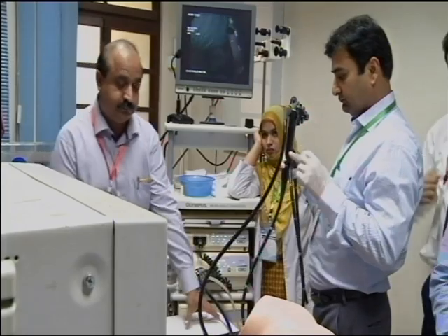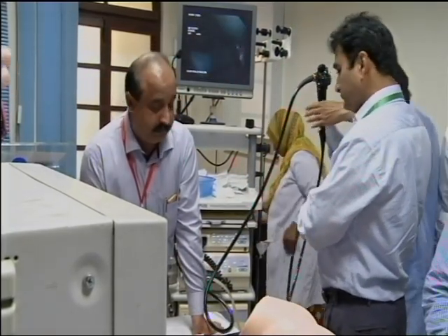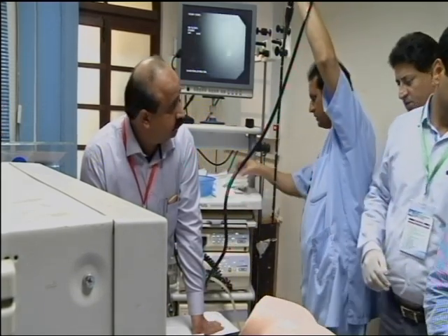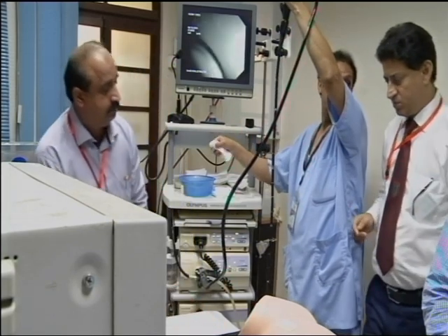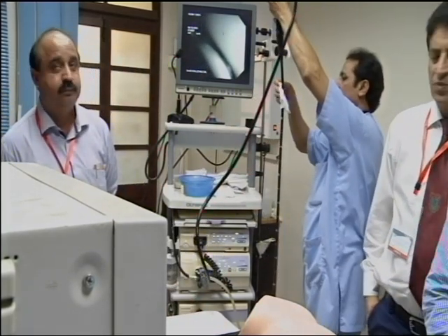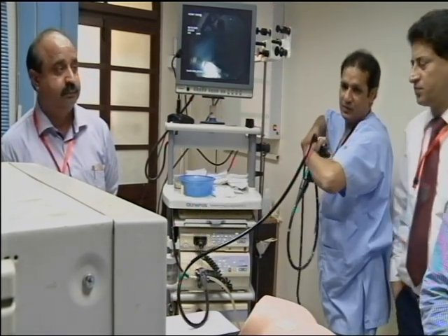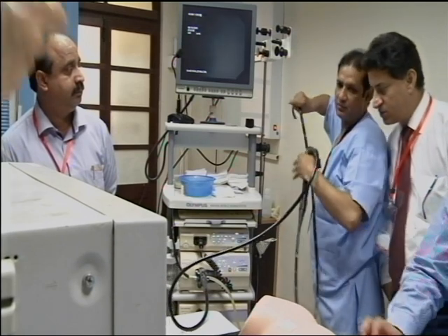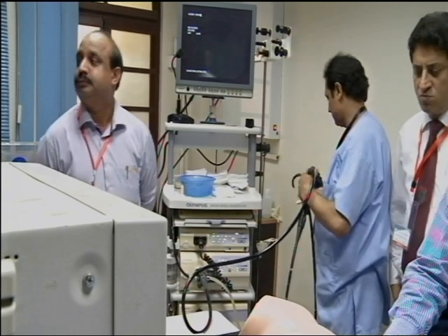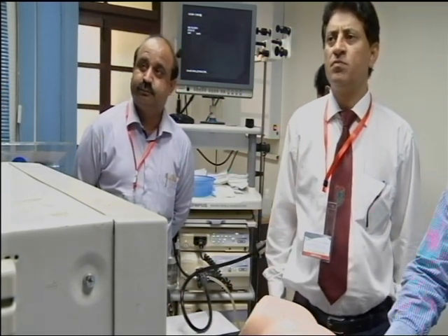But if you apply these in a plan, in a way that you comprehend and understand, then it will make sense. Otherwise, exactly what he showed, you put all the tools and you start doing it in the hope that one would work. The principle is very advanced. Make sure your scope is straight. Make sure there is no tension in your scope. Hands should be gentle. You don't need to hold the scope tight.